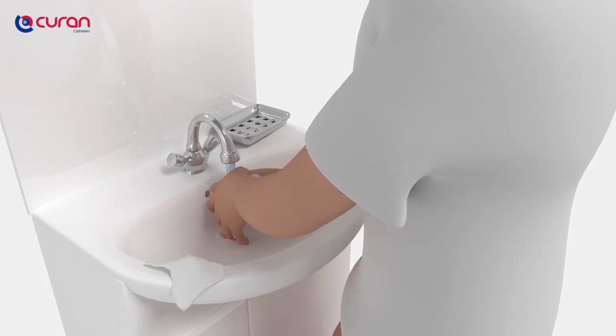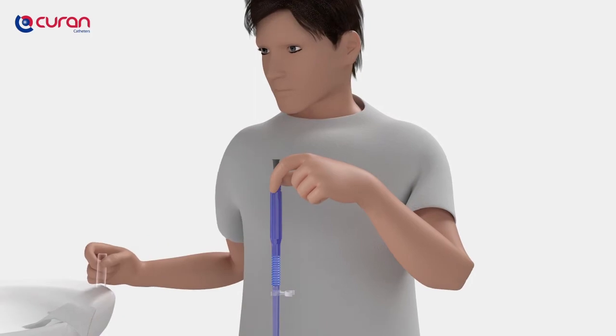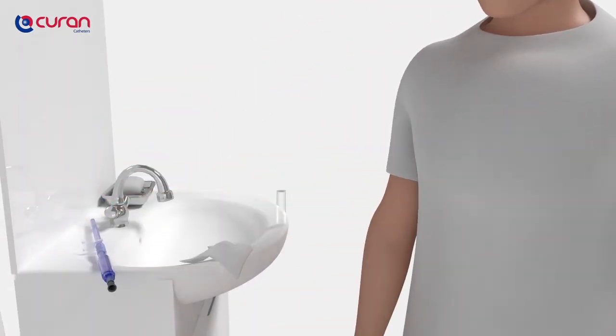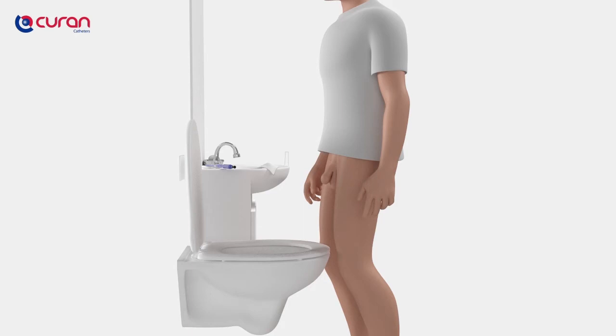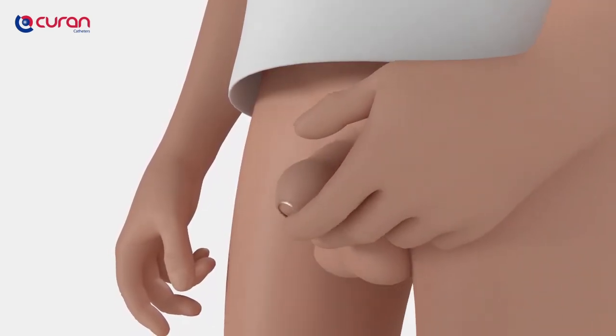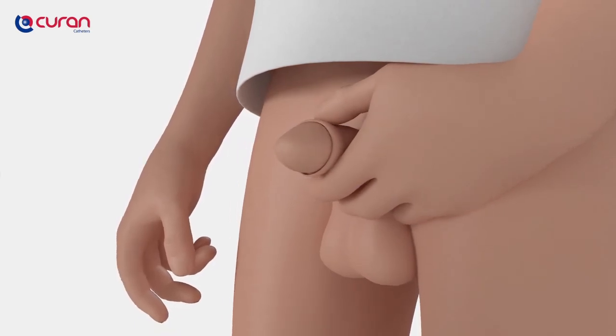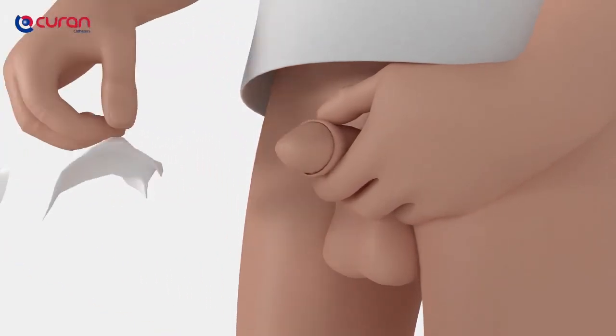Choose a comfortable position, take your time and try to relax as much as possible. You can easily open the Curan Man catheter and remove the transparent cap from the packaging. Hold and lift the penis, retract the foreskin and clean the penile urethra by using a clean wipe, using a single downward stroke to clean the penis tip.